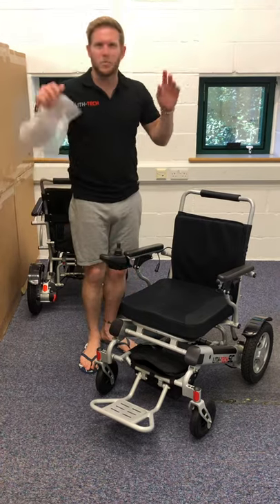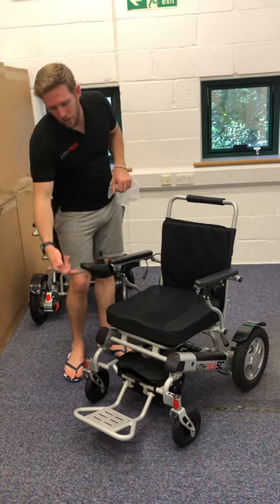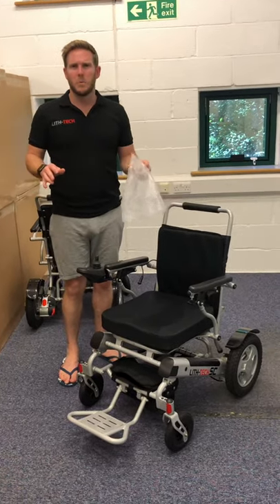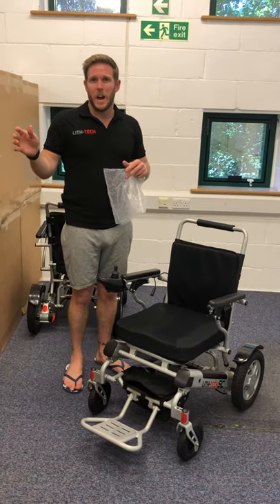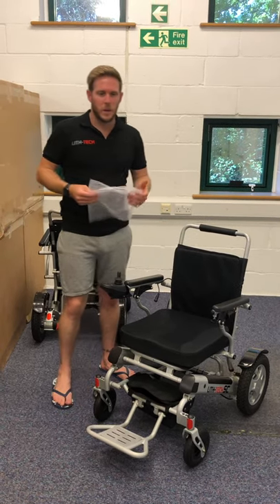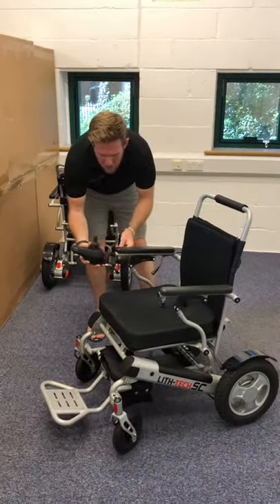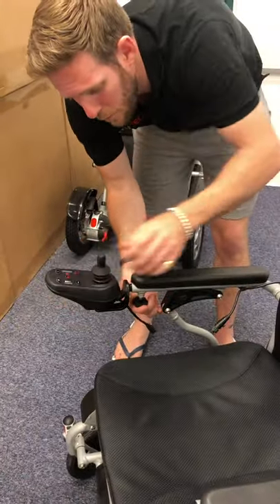The joystick is the only part really susceptible to water on this chair — it's the buttons and the charging port that are the main concern. Even if it starts raining a little, whatever you do grab the cover and put it over your joystick. The rest of the components will be pretty much fine. If it starts properly pouring down, please get out of the rain — it makes wheelchair use more dangerous and you don't want to harm the joystick.